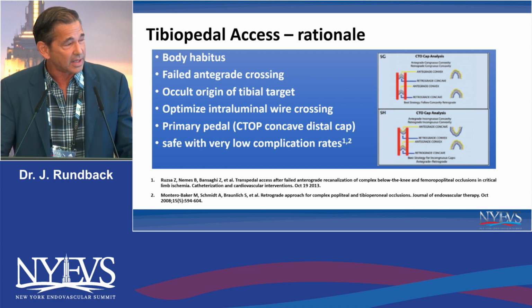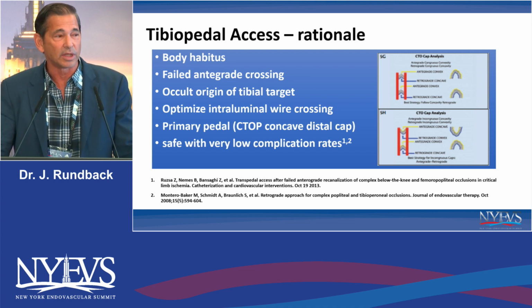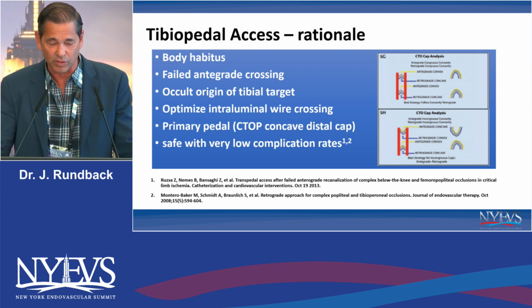We have found that most of the time it's easier to cross retrograde than antegrade and remain intraluminal. You're more likely to get subintimal in many cases, if you go antegrade, and if you want to preserve all treatment options, particularly plaque modification or vessel preparation options, having intraluminal wire positioning is really critical.